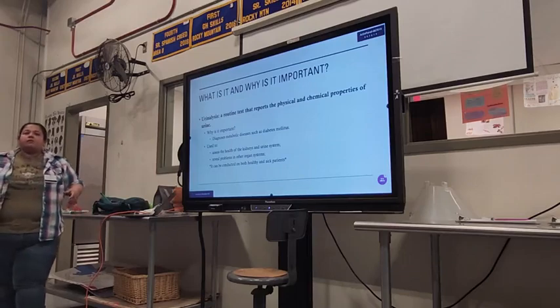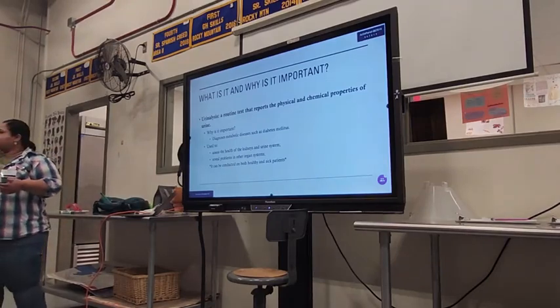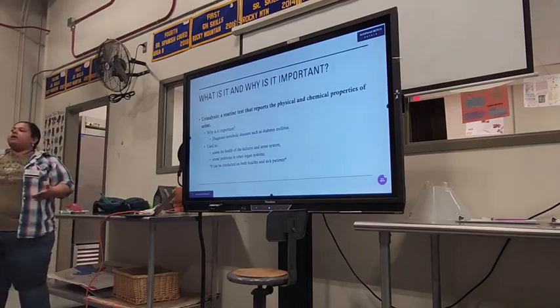Now, a urinalysis does not only have to be conducted on a sick patient. It can be conducted as routine screening on a healthy patient. Okay.